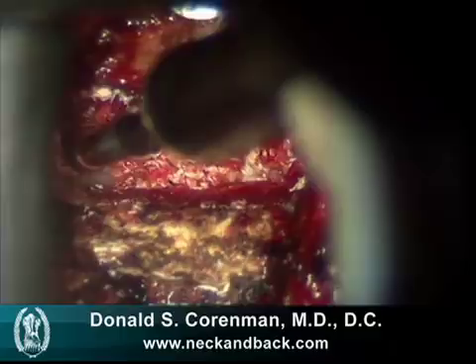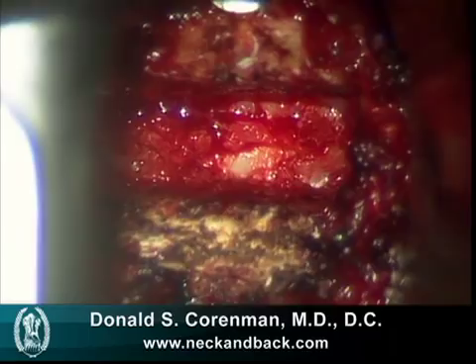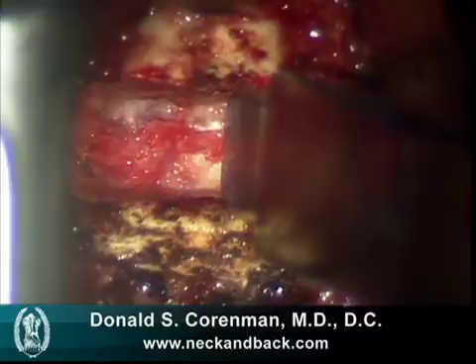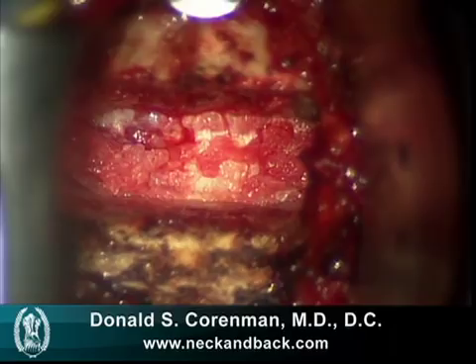Also, we see the end plate being parallelized. Here's the finished product, so to speak. We irrigate to make sure we wash out any debris, and then we check for the height of the graft that's necessary. We'll use this little device — you'll see it being pushed in there, it expands the vertebra. It's not perfectly ready yet, so a little more trim and a little more parallelization, and then we'll put that spacer in, and you'll see the spacer fits quite nicely. We know we're ready for the graft.